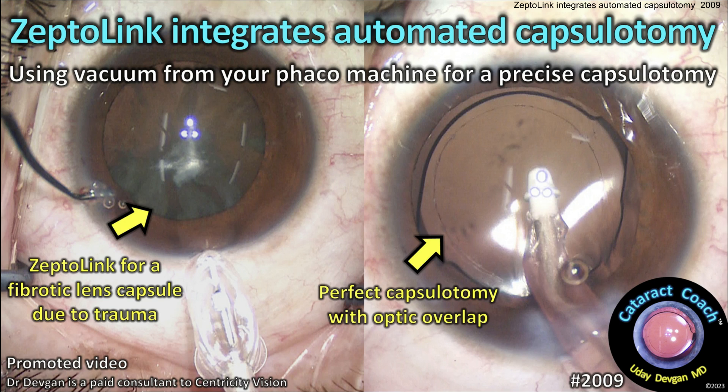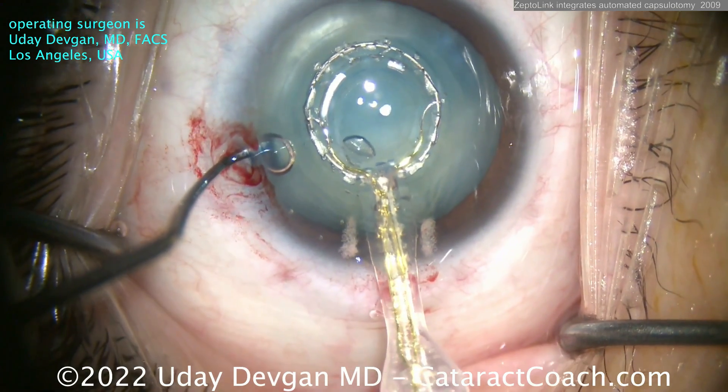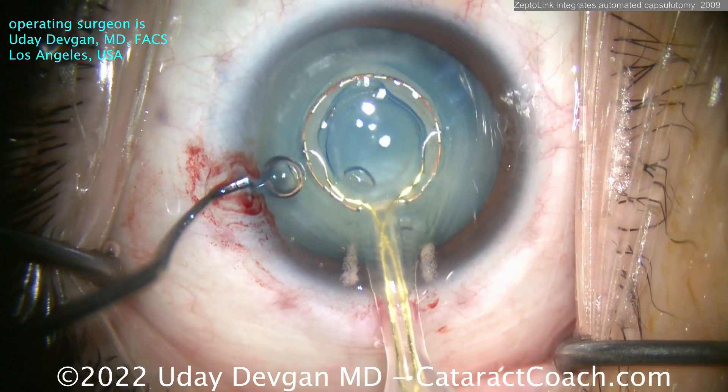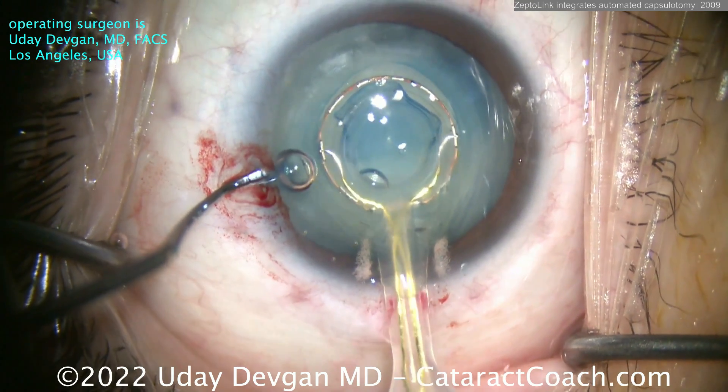Now you remember the Zepto device that we've shown before? Here, a year ago we used it to make a capsulotomy — pow, just like that — instantly in that intumescent white cataract. How easy was that?